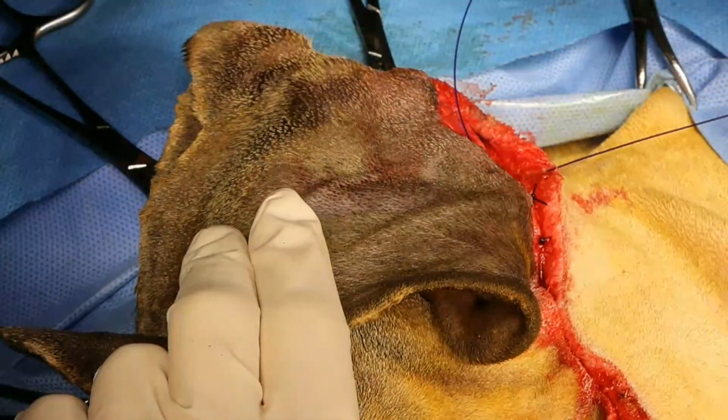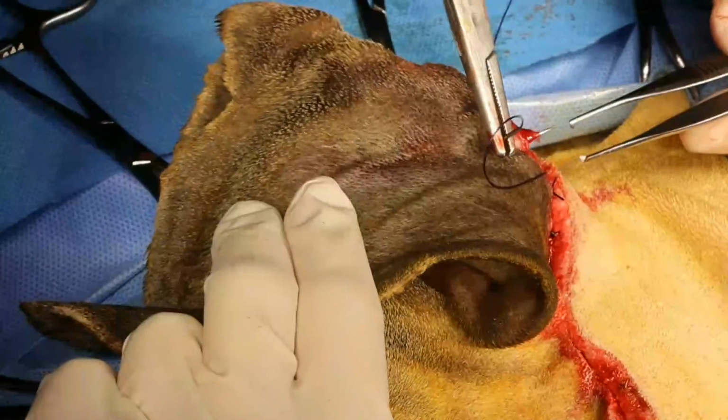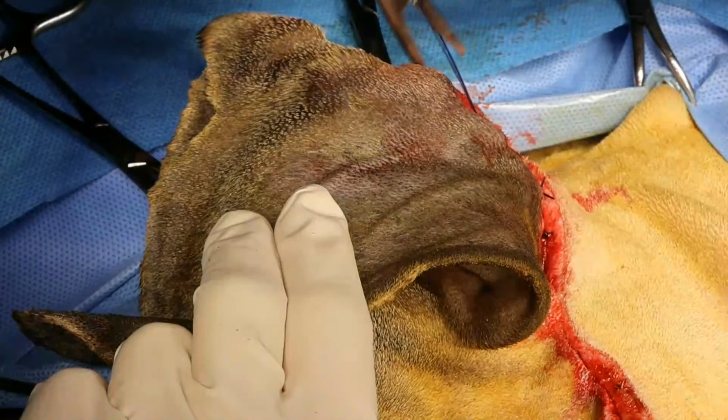And so I'm intentionally not going too deep with these sutures. Can I get some more O, please?